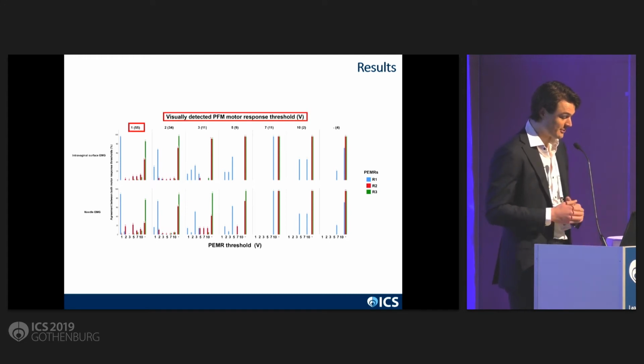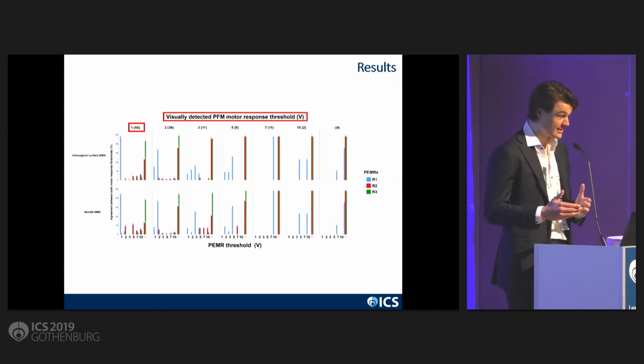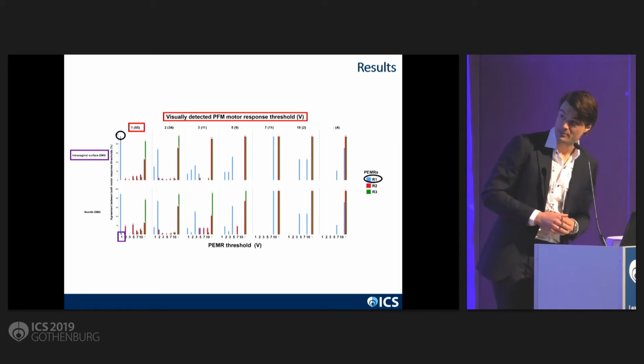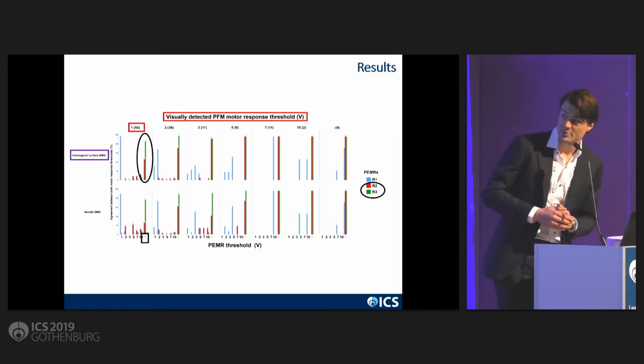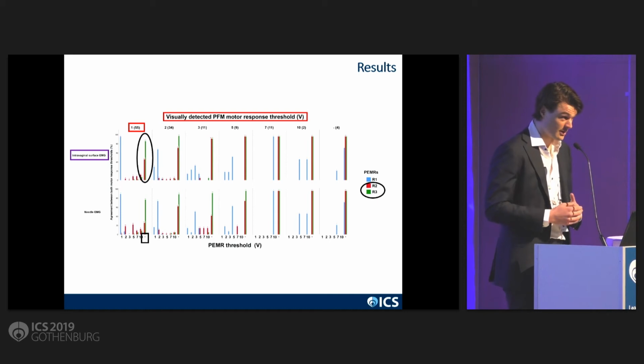So, for example, of the 55 stimulations which were visually seen at electrodes at a stimulation intensity of 1 volt, a first EMG response was seen in 53 cases, while if we look at the second and third EMG response, this was mostly not seen, although clearly at 1 volt a visual inward contraction was seen.